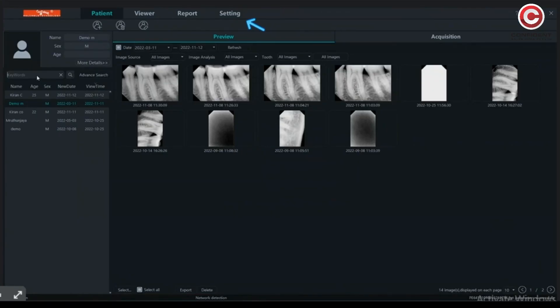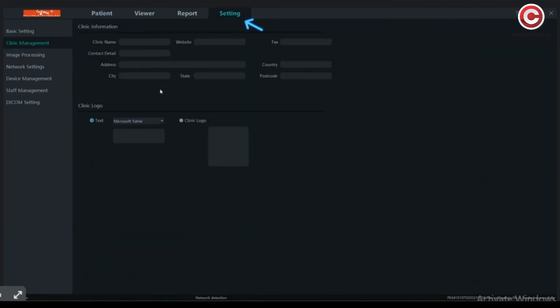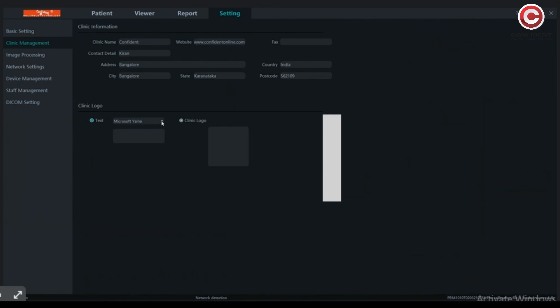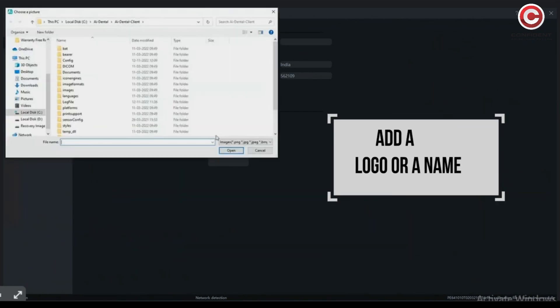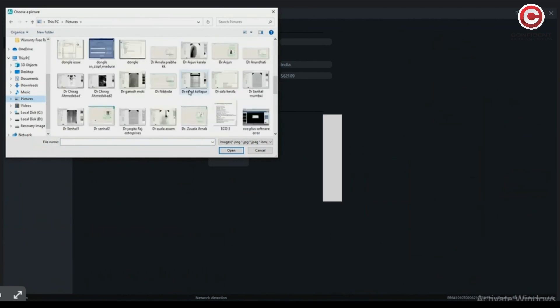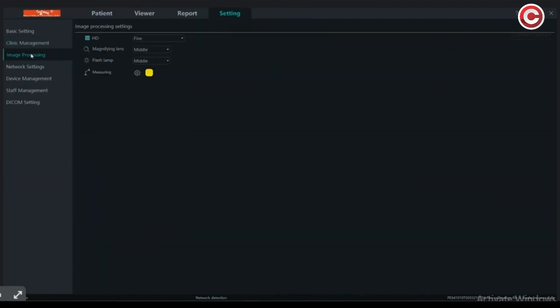Once you have logged in, go to the Settings tab and enter the details of your clinic or hospital. Add a logo or the name you want to show in the reports. Change the settings of image processing to suit your needs.